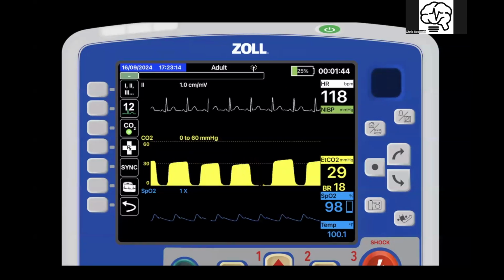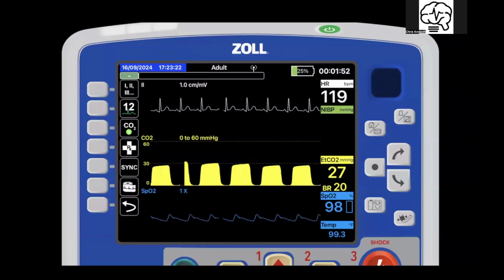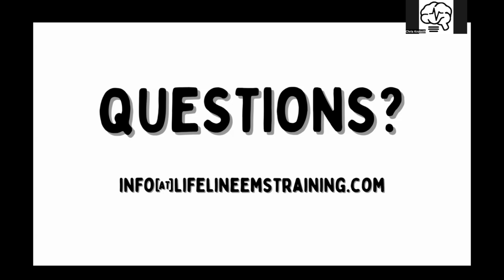And remember, bicarb plus hydrogen equals H2O and CO2. So when the bicarbonate goes down and the perfusion goes down, CO2 plummets. And that's really when we see people in severe septic shock. When that end tidal really gets below 24, that's a bad day. That's what CAPNO would do in this case for sepsis.